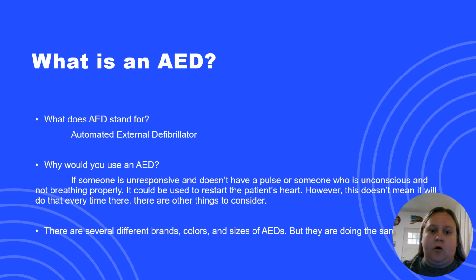Other times that we may use the AED is someone who is unconscious and maybe not breathing properly. We may suggest putting the AED on, because depending on the type of AED that you have, it can help us determine what's going on there.